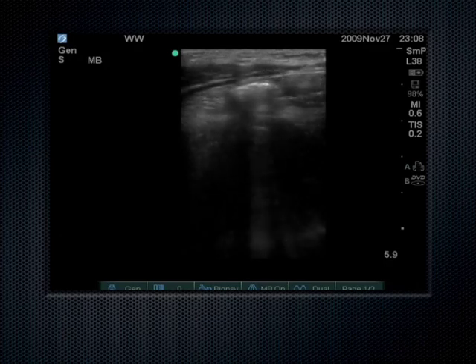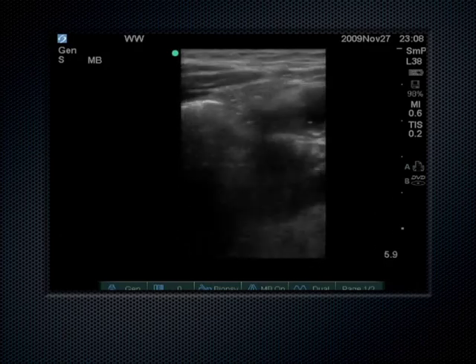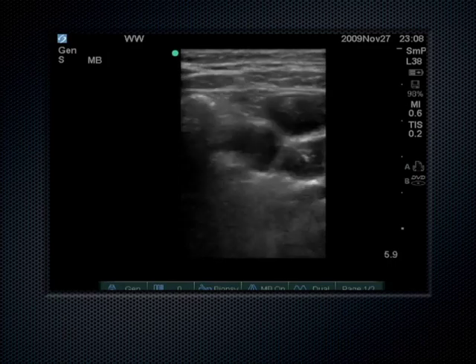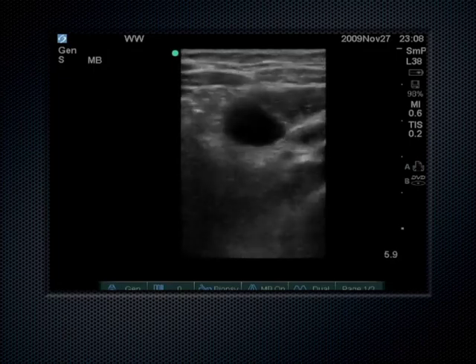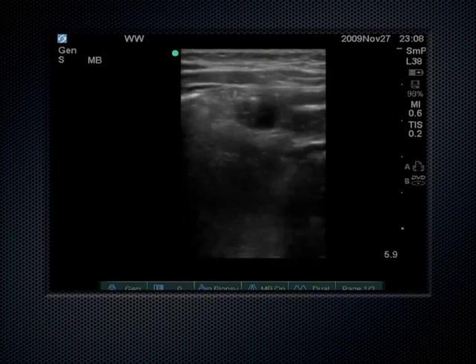And yes, this is a lot easier in thin patients. And yes, this is a truly fentanyl-dependent thing because look how much we're compressing this tissue. Now, if you have appendicitis, all these areas down here in the peritoneal cavity get inflamed, and it's very painful to be compressing these things. This is the peritoneal lining right here. I can see that peritoneal lining very easily on ultrasound.